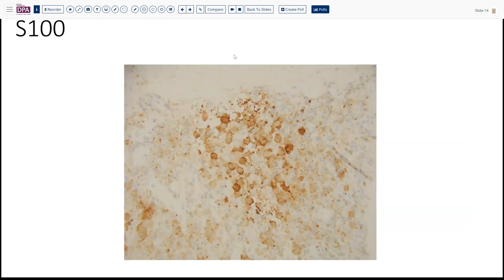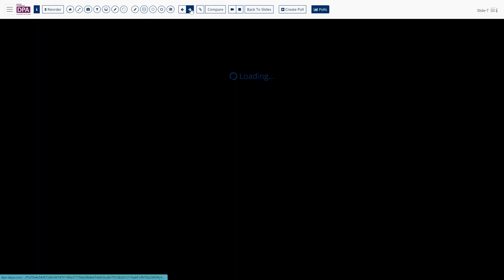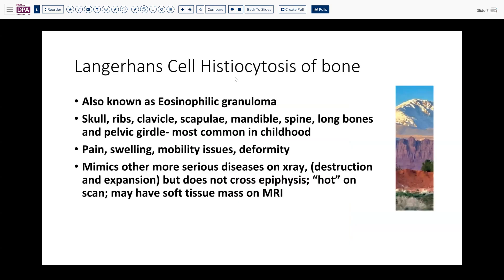This is not perhaps the best S100 stain, but that leaves us with a diagnosis of Langerhans cell histiocytosis of bone, or eosinophilic granuloma. This lesion is most common in childhood and can affect a variety of bones including the skull, ribs, clavicle, scapulae, mandible, spine, various long bones, and the pelvic girdle.